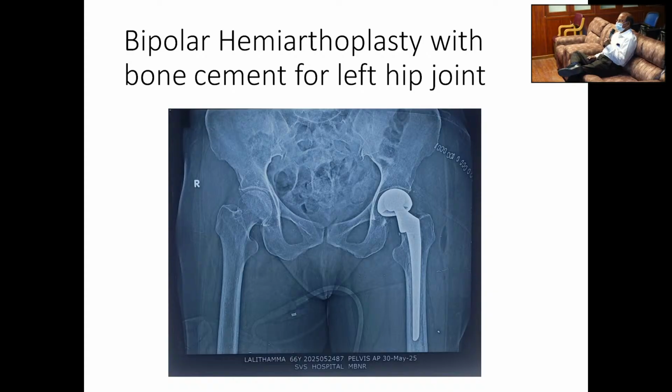See, the top of the greater trochanter is falling to the center of the head of the femur. Here, where is it falling? It is falling over the neck. Was the reduction easy or tight? Easy, sir. Reduction was easy.